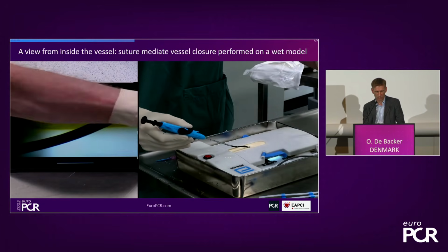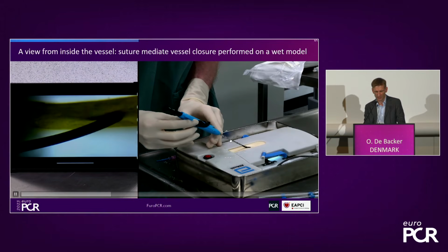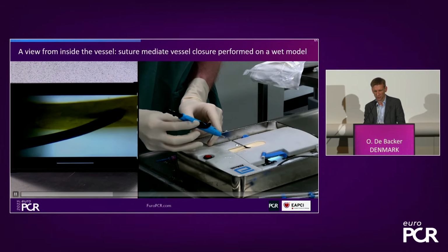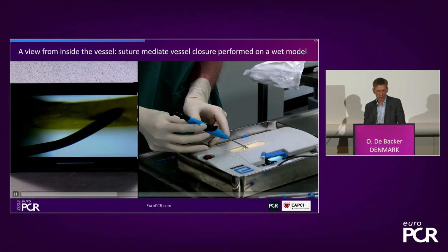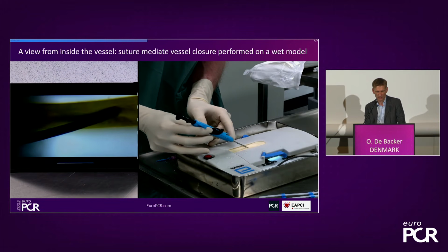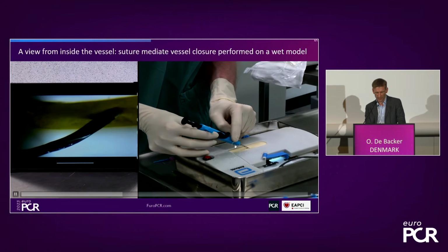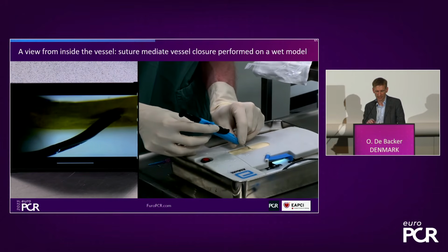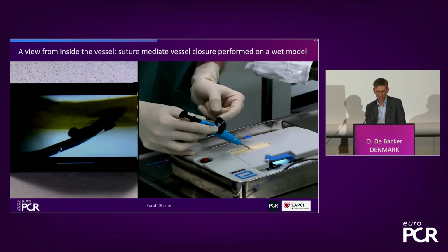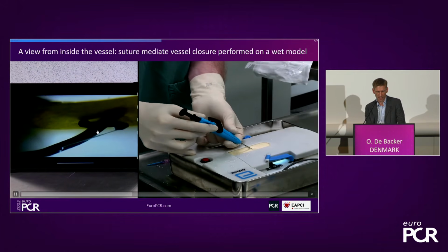I think what's also been improved is, for example, this hub to cut your suture. You have this marker, but I don't personally use these marker lines on that metal part a lot. But here now, this is important. Here you will see the bleed back. When you come in here, you will see this is the bleed back. That's the moment you know your anchor is actually in. And look at this now. When we put this lever up, we will get this anchor coming out, yeah?